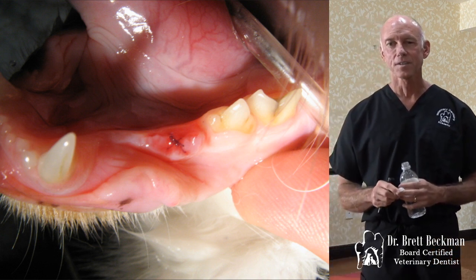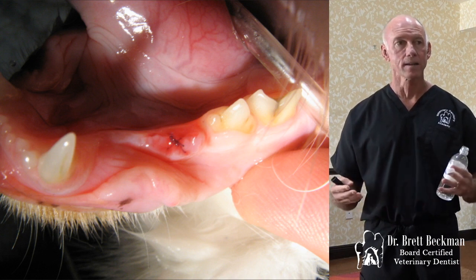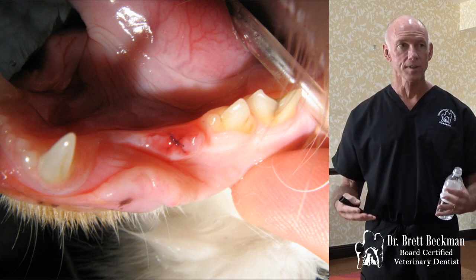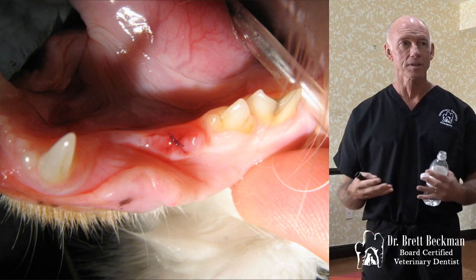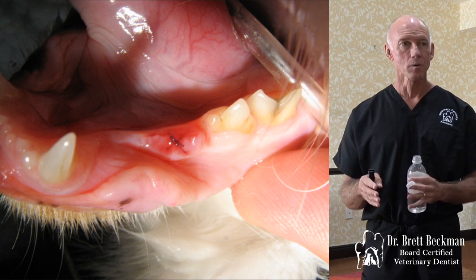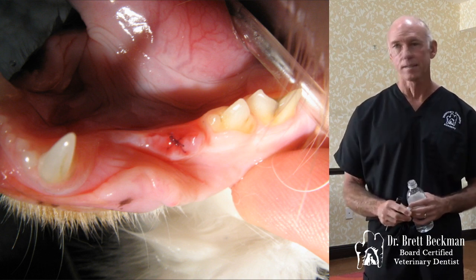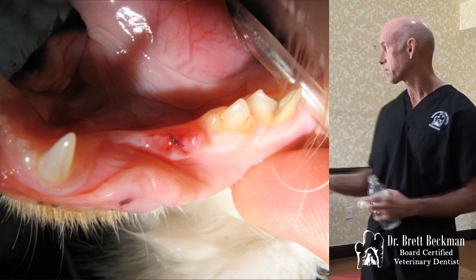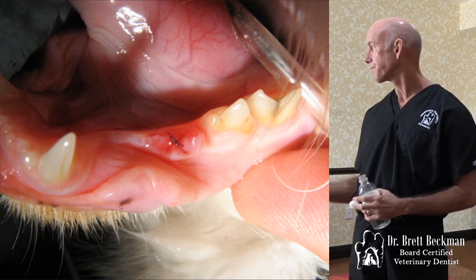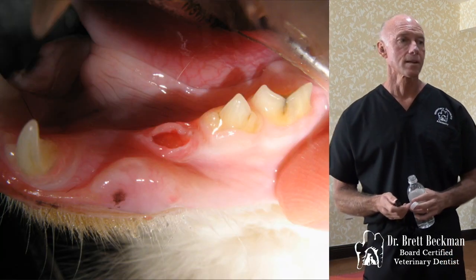We need to take into consideration that we're going to have a really aggressive flap to bring that normal tissue from the ventral to the dorsal to cover that. We'll probably have to do at least a bilateral releasing incision to bring that up after we excise that tissue. We don't want to do that. So just leave a little bit of the inflamed margin, about as big as we did there, even if it's inflamed, and close it.